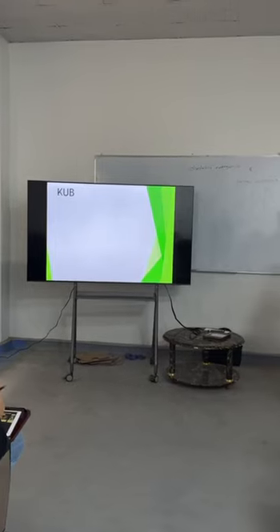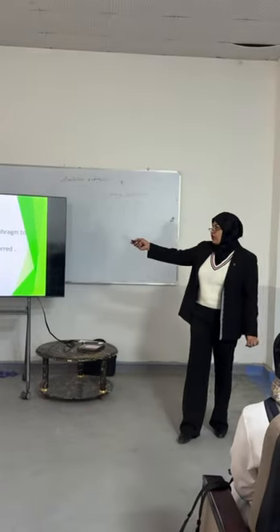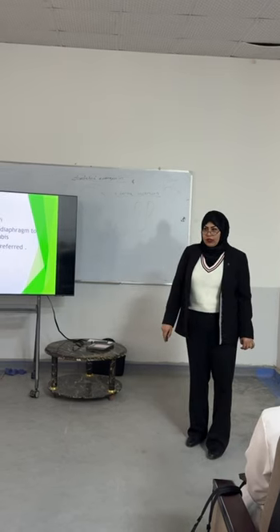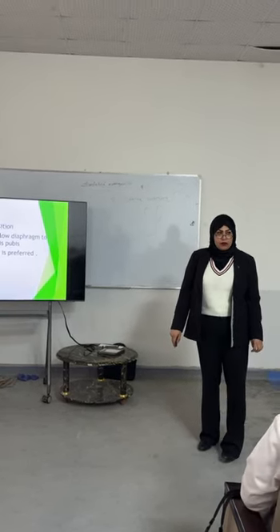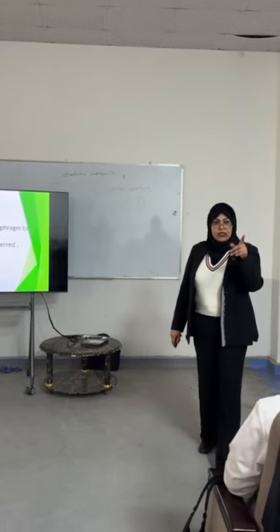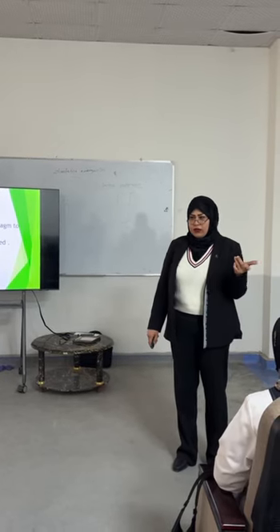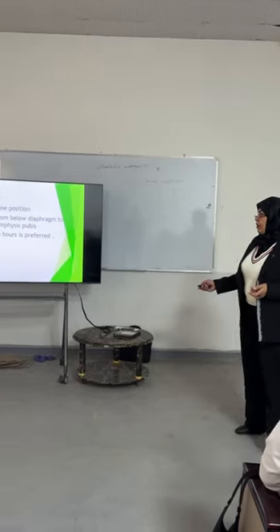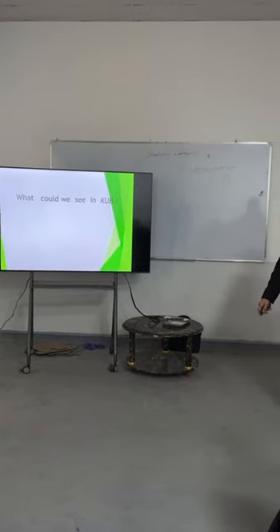And the question for you is, why do we fast the patient for 6 hours before? Why? Gastric... Yes, the air that is inside the bowel. The gas of the bowel. To get rid of the gas of the bowel, so we could see in KUB.